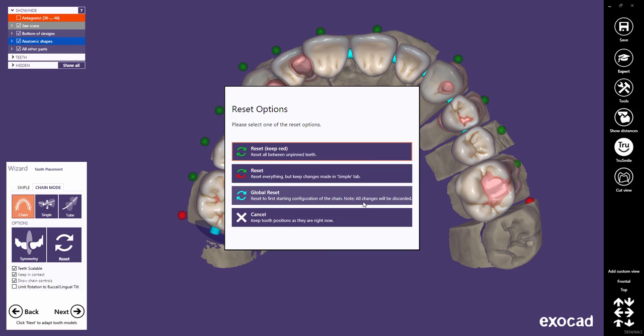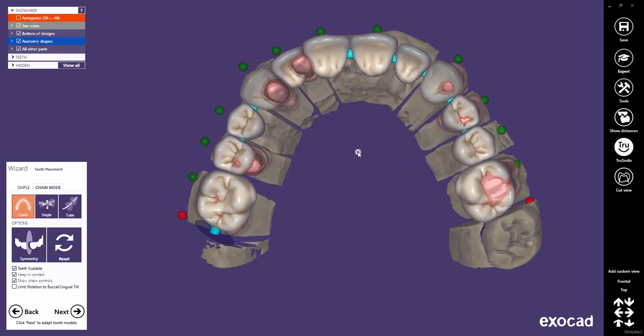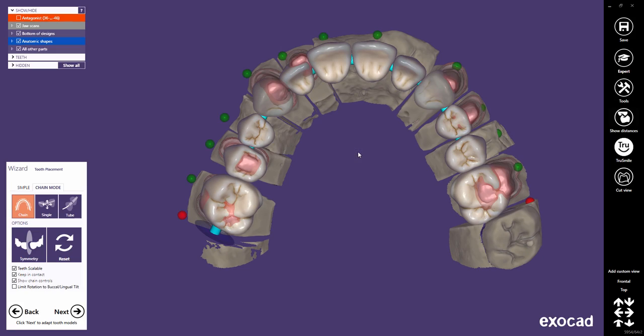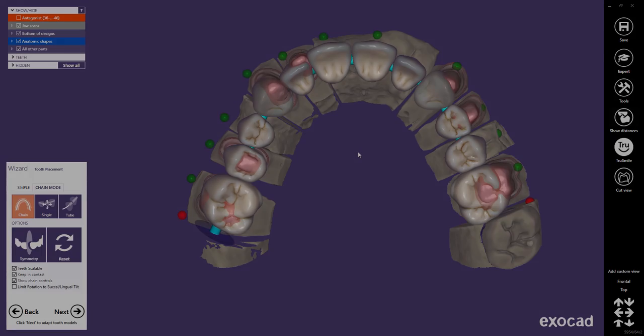The third option resets everything to the initial tooth placement. The last option closes the reset window and all tooth positions remain as they are. Let's choose Reset, as it might be the most important reset.